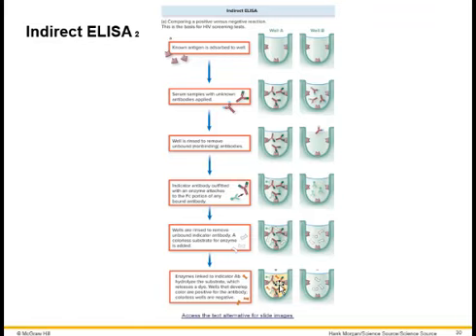A lot of times it is a yellow color that you get. We did one which was a green color in lab, but sometimes it's also red. So there are various different colors, but a color change would indicate that the patient's blood had the antibodies for the antigen. That's what an indirect test does. It tells us indirectly that the patient has been exposed to the antigen.